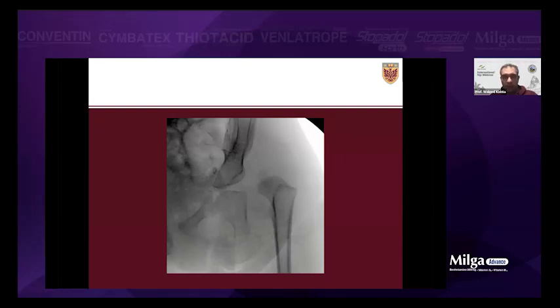Straight rectus head. Perfect. Splitting the apophysis. Long head of rectus tenotomy. Opening the apophysis plus rectus. Perfect. So there is some sort of agreement for the next step.